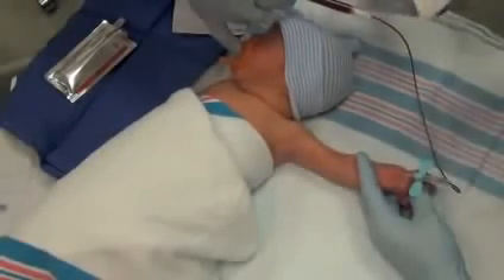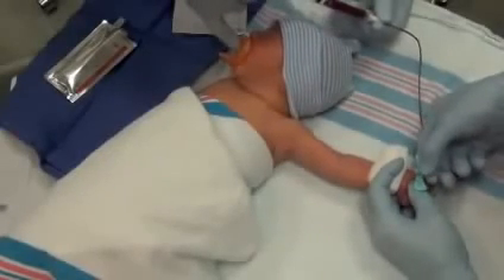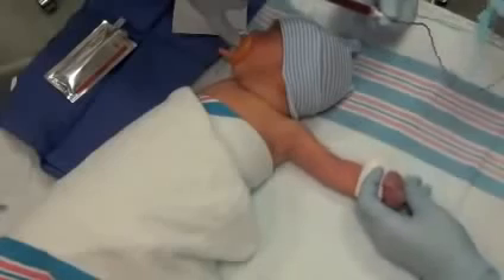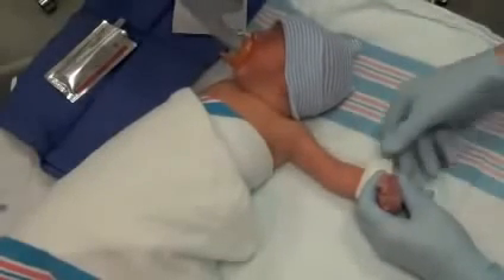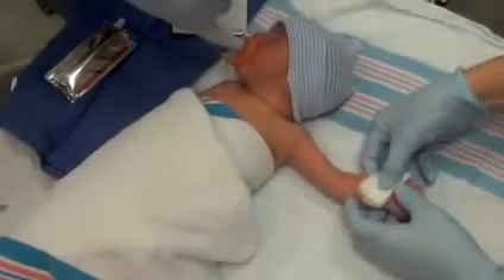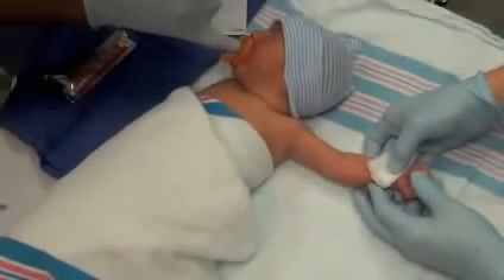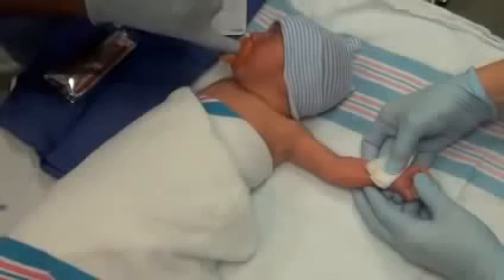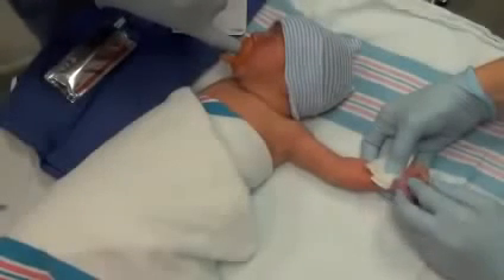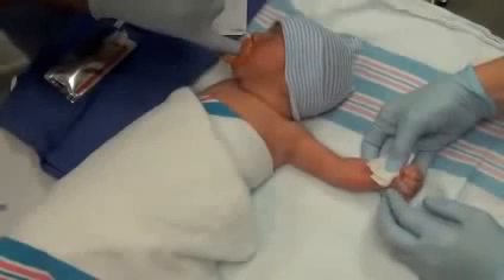When the blood collection is completed, remove the collection set while simultaneously compressing the insertion site with sterile gauze until hemostasis is achieved. Be certain to assess for appropriate peripheral blood flow at the completion of the procedure. Peripheral arteries can be located by palpation or transillumination. The palpation method was demonstrated in this video.